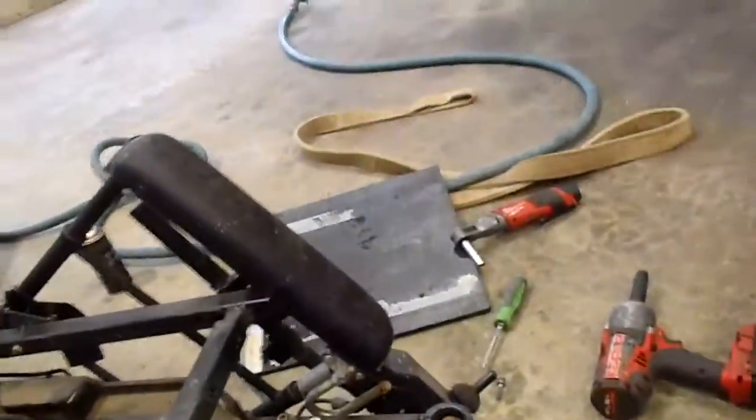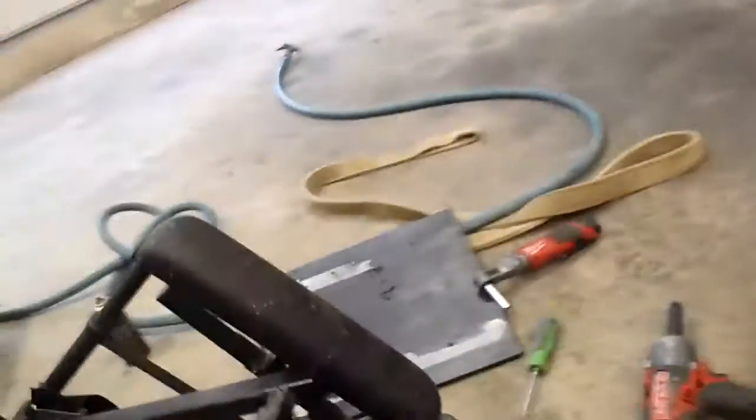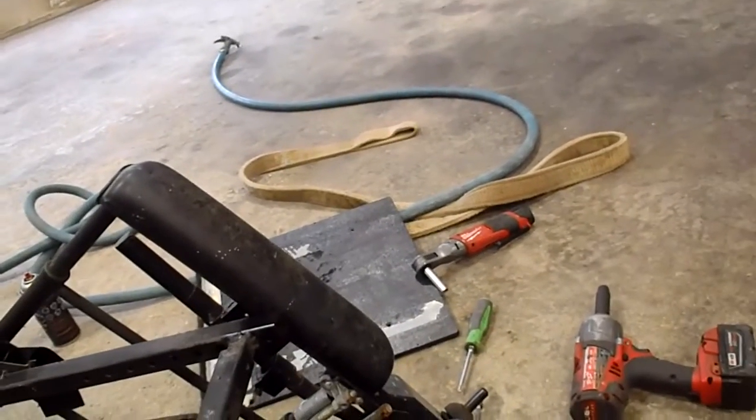Okay, getting this thing tore apart here, and I'm getting the seat disassembled that's going onto the wheelchair as well. Now that I've got the plate, that plastic plate that the cushion was sitting on originally, it's pretty basic. It's got a chunk of aluminum angle iron on the back that you can see there, some Velcro that the original seat cushion would have stuck to. Pretty basic, nothing fancy. Here's the seat frame.